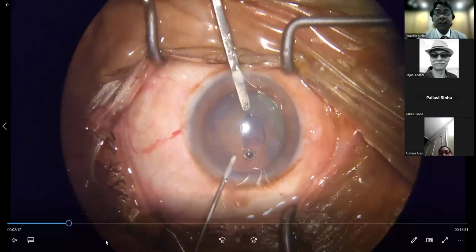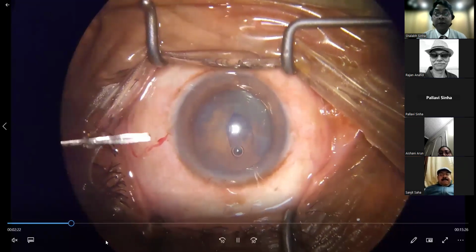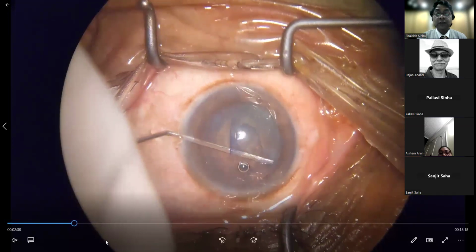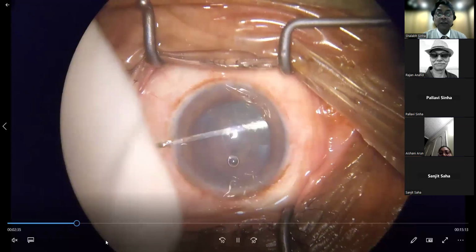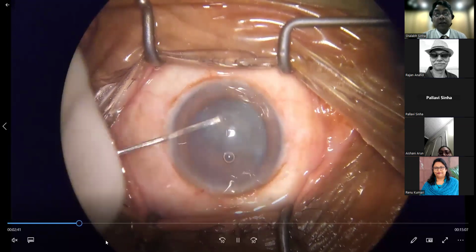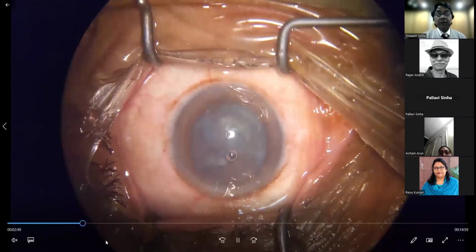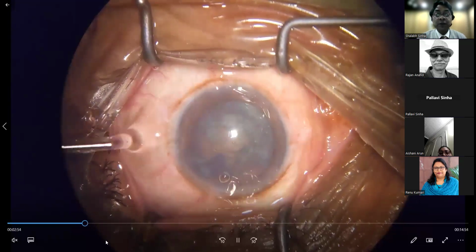The spatula in the left hand not only stabilizes the eye, but you can also use it to flatten out the flap if required. And then the hydrodissection using a flat 25 gauge cannula. After doing some hydrodissection, visco is placed inside the eye.